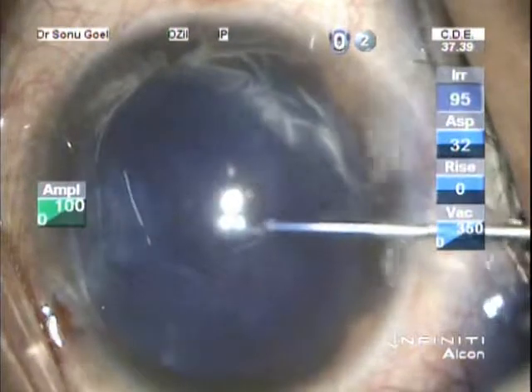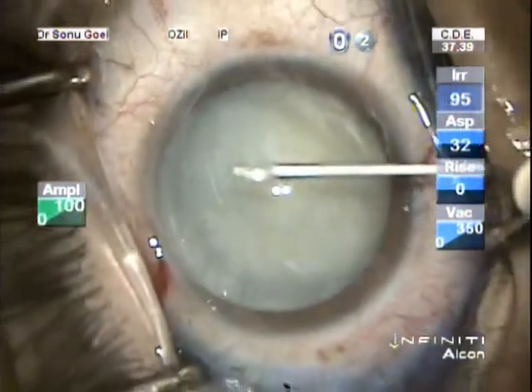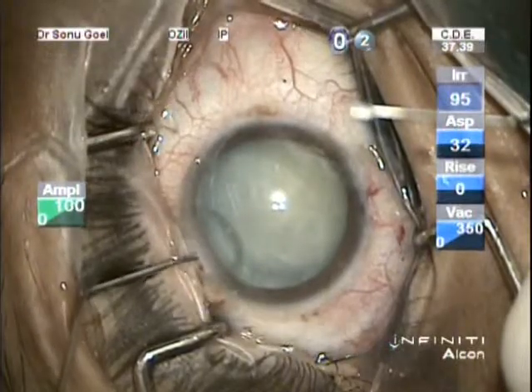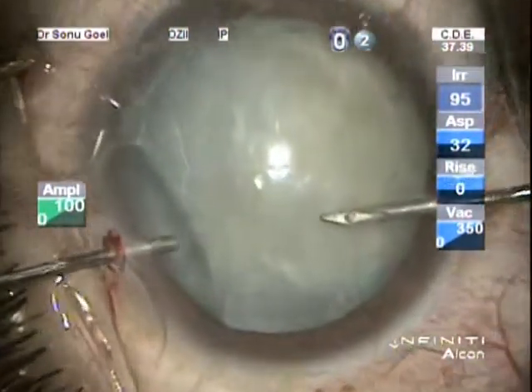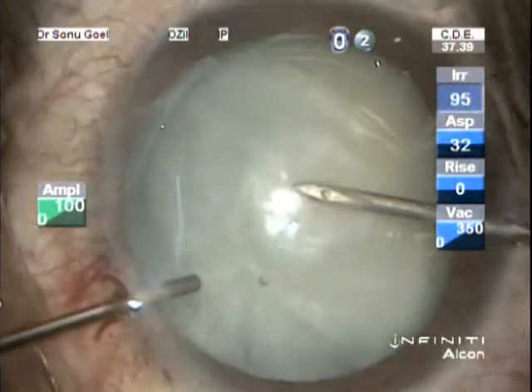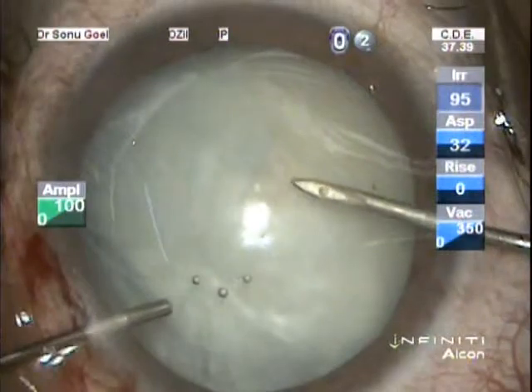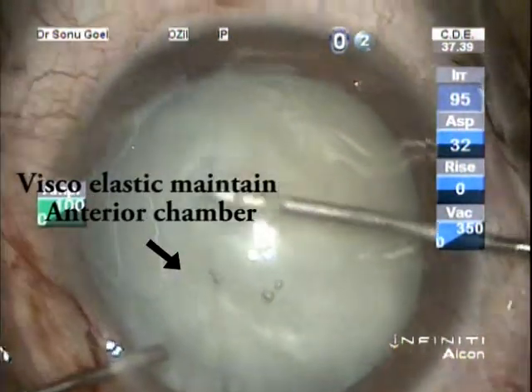Viscoelastic is gently injected to drain away the trypan blue, and then we introduce the cystiotome from the side port and the viscoelastic cannula, as you can see here, from the other side port. Note is made that under topical anesthesia the globe is stabilized. All throughout a positive pressure is maintained. The visco is being gently injected all throughout the procedure. As you can see here, the air bubbles move continuously, showing that the visco is being injected, which drains out through the other side port.